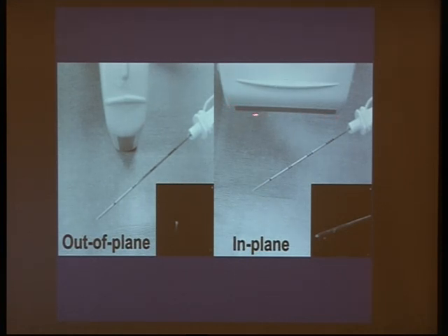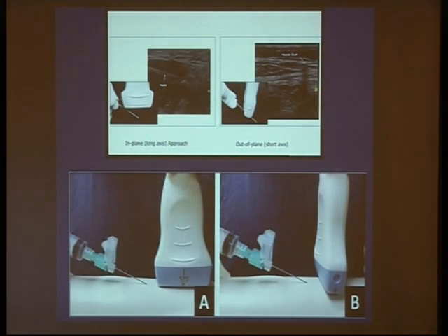On the other hand, longitudinal position of the probe is also called in plane, because you are continuously going through the ultrasound plane. Again, this is out of plane or transverse position of the probe, and this is in plane or longitudinal approach.